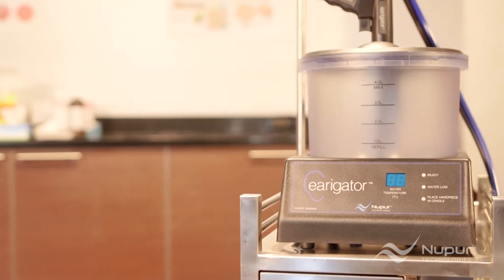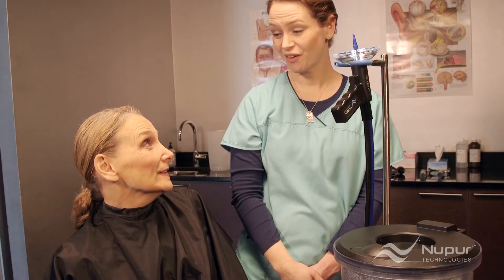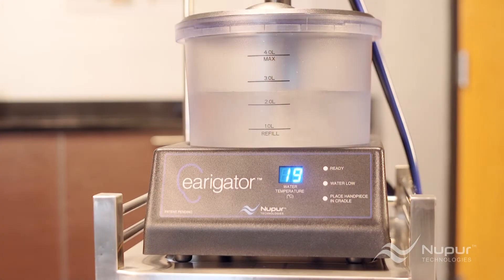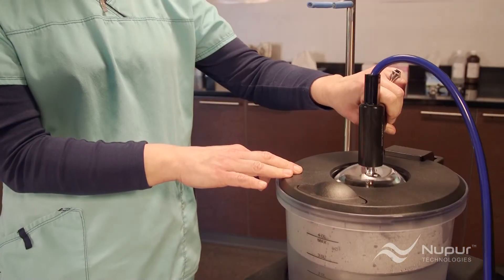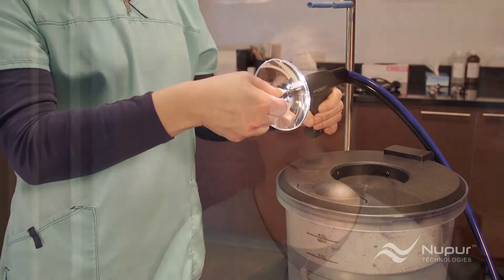It's so safe that with only a few minutes of training and practice, your non-medical personnel can perform the procedure. In this video, you'll learn how to operate the irrigator and use its state-of-the-art technology to quickly remove the patient's earwax. Meet Rachel — she's used the irrigator for over 15 years on more than 10,000 patients, and she's going to help us demonstrate the proper procedure.